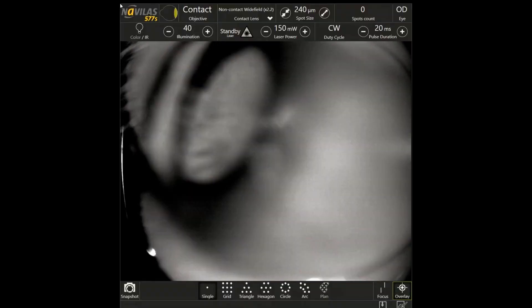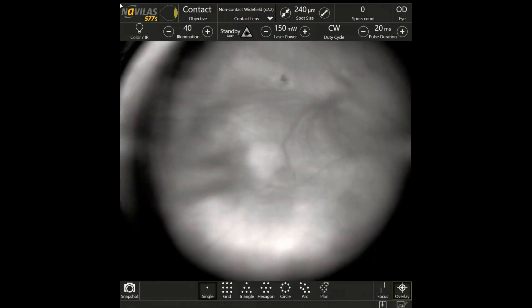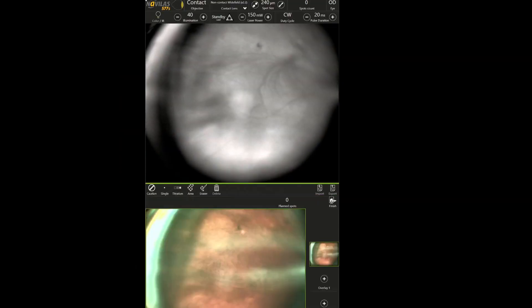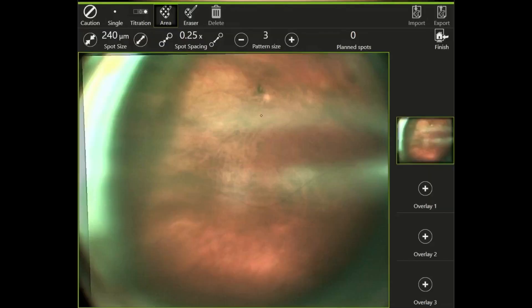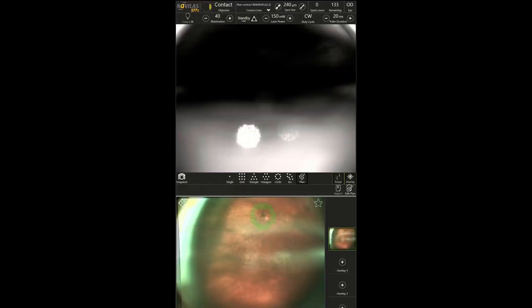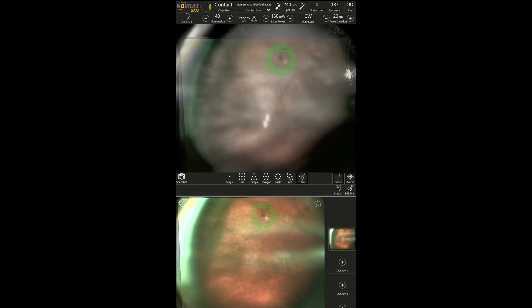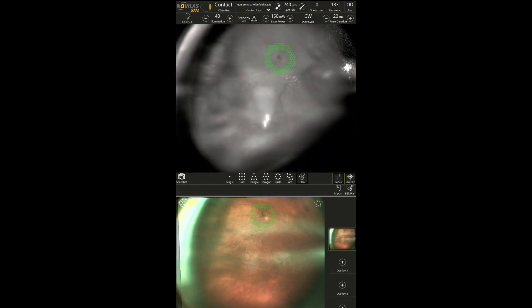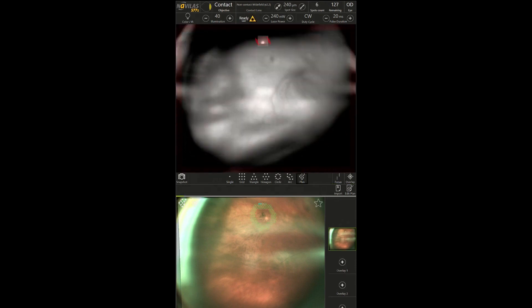The whole treatment process was performed under the circumstances of infrared fundus lighting. We used a non-contact objective to make a fundus photo, then planned further treatment with three rows of practically confluent laser spots. We then focused on the zone of peripheral changes by passing the corneal opacity. After applying several test burns, a fundus photo was made to determine sufficiency of laser power.